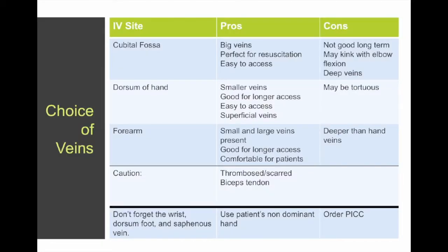So the next thing is, where will you put this cannula in? There's a number of different sites with pros and cons for each site. A really good rule of thumb is I try to use the minimum size of cannula required and put it on the most distal vein that satisfies that need.